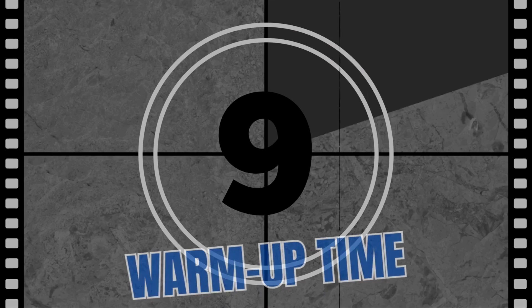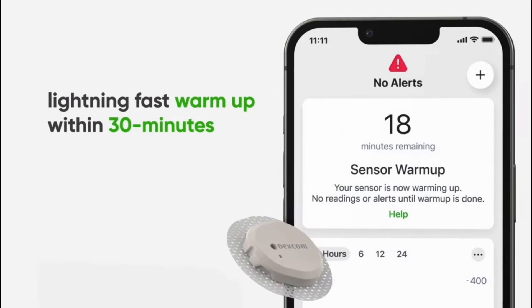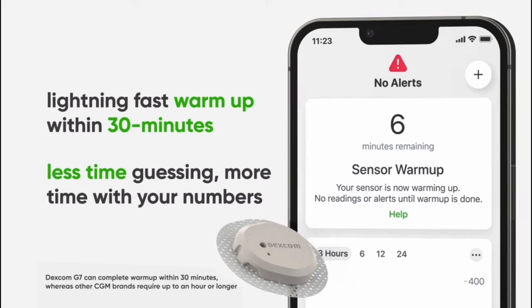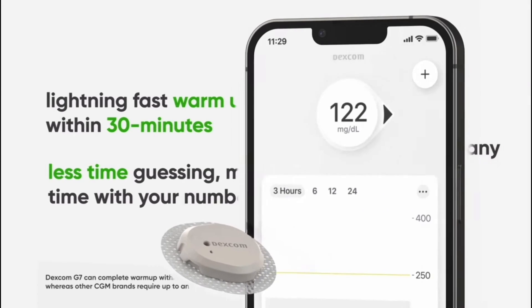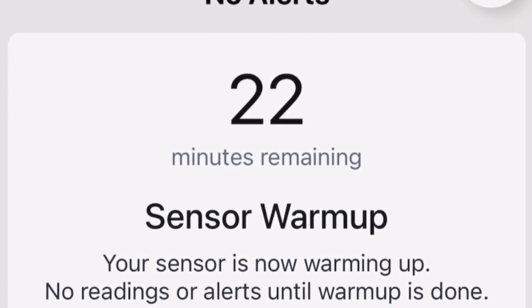Let's talk about warm-up time. The Libre sensor, just like its predecessor, requires 60 minutes before you can start using the CGM. The Dexcom G7, on the other hand, now has the fastest warm-up time of any CGM, clocking in at less than 30 minutes. And due to the sensor automatically starting once placed on the arm — thanks to those magnets — by the time I put the sensor code in, the countdown was already down to just 22 minutes.